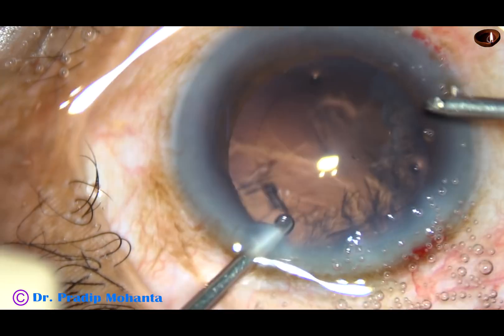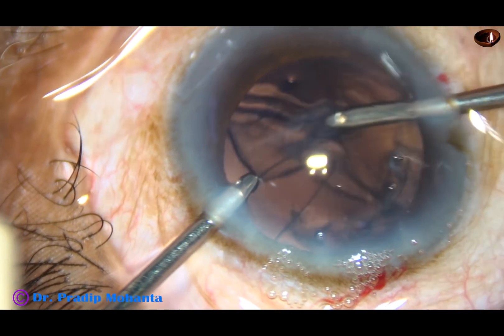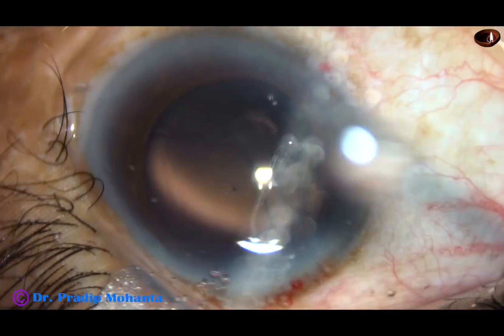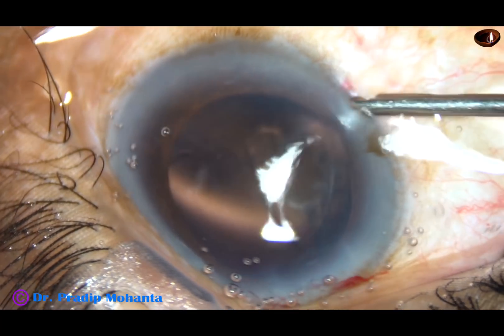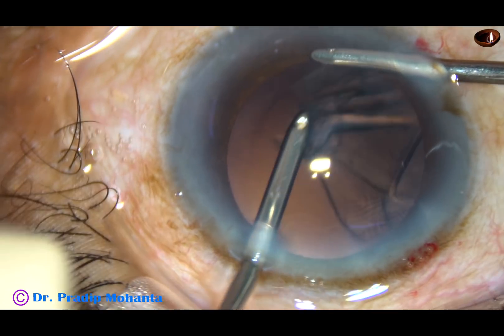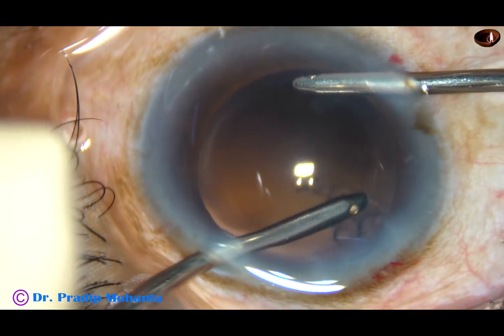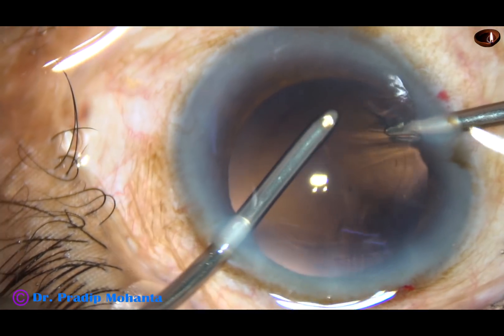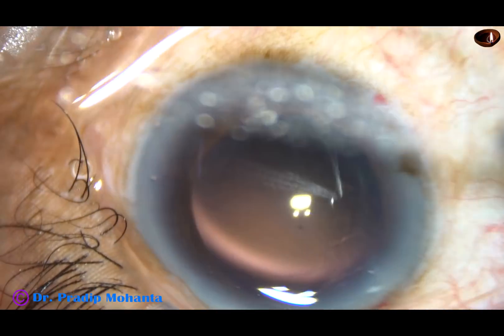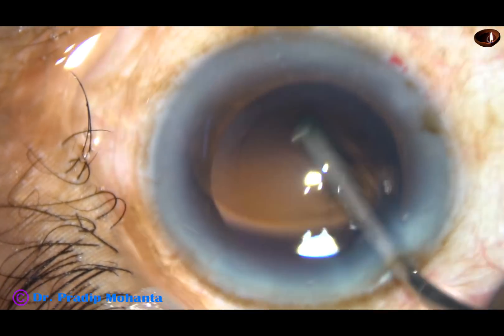Irrigation is from the left, aspiration from the right. The cortex can be very nicely and elegantly removed by bi-manual irrigation aspiration. We must hold the anterior portion of the cortex just underneath the anterior capsular rim and not the portion which is over the posterior capsule. This is hydropolish.